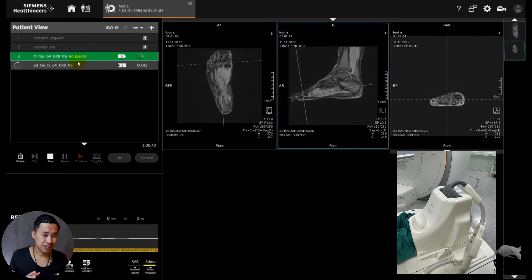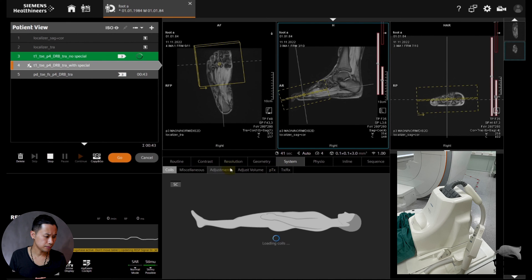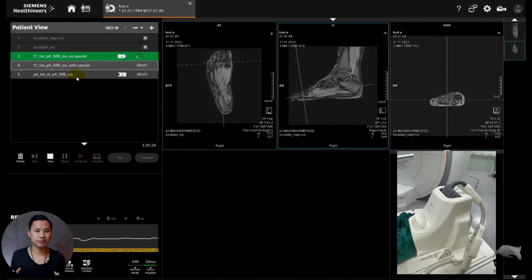Then we're going to do the same sequence but this time we're going to turn the special purpose coil on. And we're going to do the same on the PD just to have a comparison — coil on and coil off.